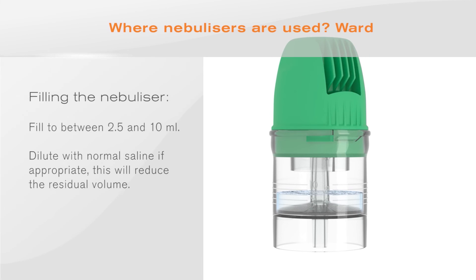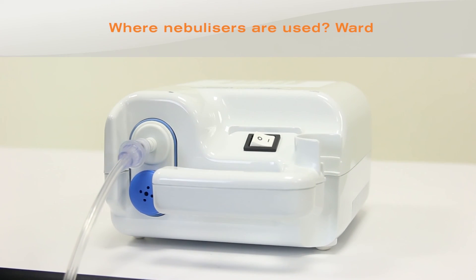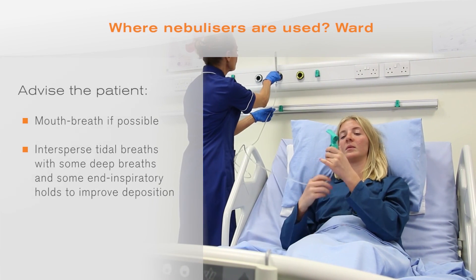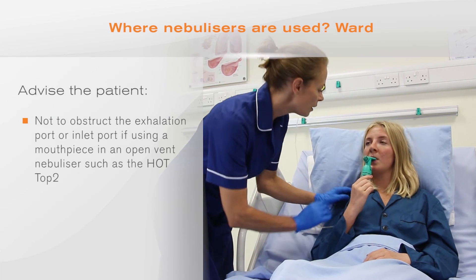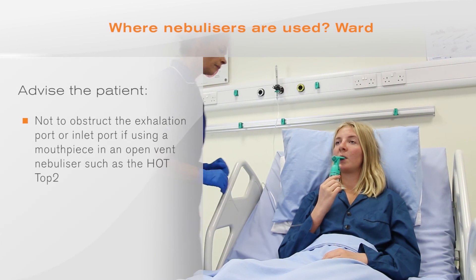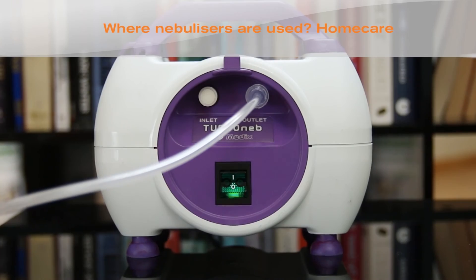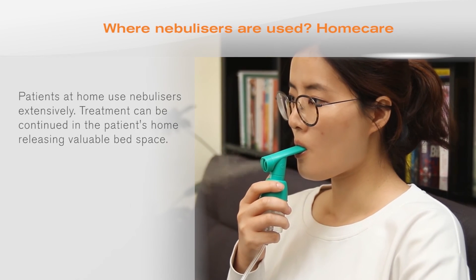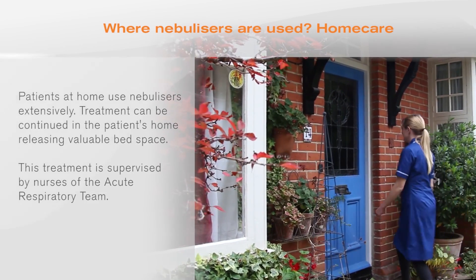Set the flow rate to 8 litres per minute unless a compressor with a preset flow rate is used. Advise the patient to mouth breathe if possible, to intersperse tidal breaths with deep breaths and end-inspiratory holds to improve deposition, and not to obstruct the exhalation port on a mouthpiece or the inlet ports on an open vent nebuliser such as the Hot Top 2. Patients at home use nebulisers extensively, allowing hospital treatment to be continued at home and releasing valuable bed space, supervised by nurses of the acute respiratory team.